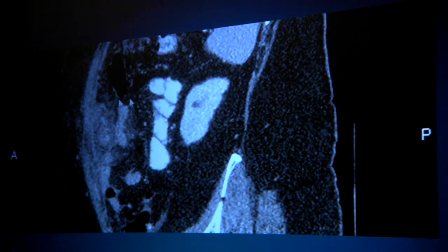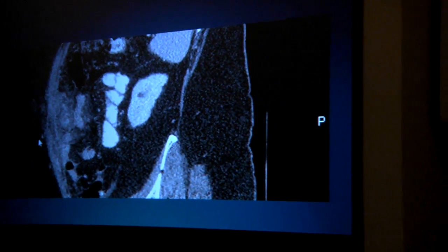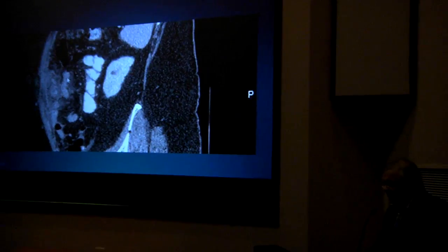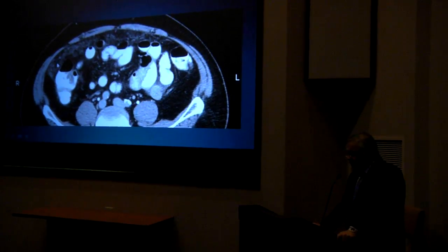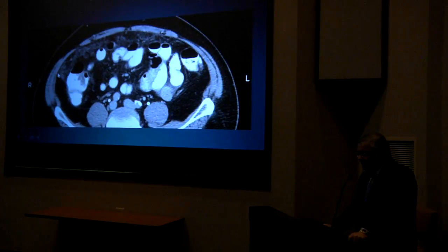More often than not, we see what we refer to in our department as dirty fat. A patient will come in with perhaps nonspecific symptoms. They don't feel well, they feel bloated. We do a CT scan, and lo and behold, we kind of see some medium volume disease. Here we have tumor studding. This is pretty typical and very commonly seen in the omental fat. And these are not problematic diagnoses.